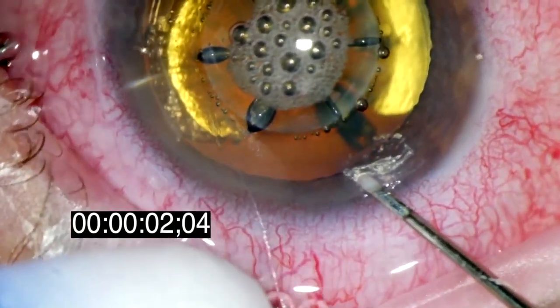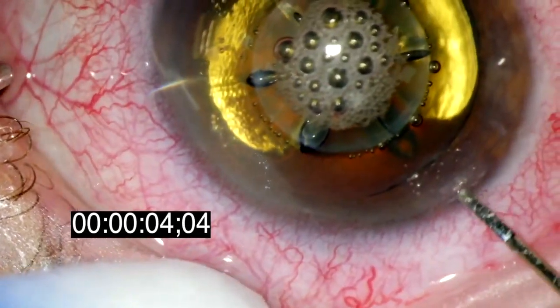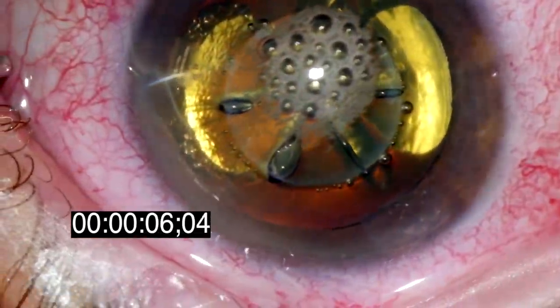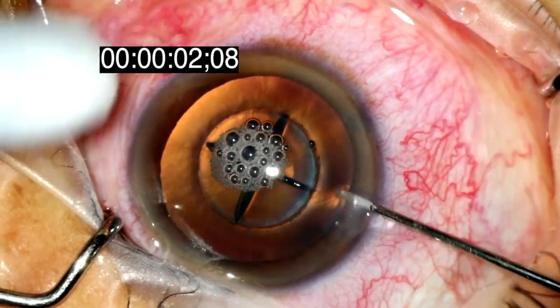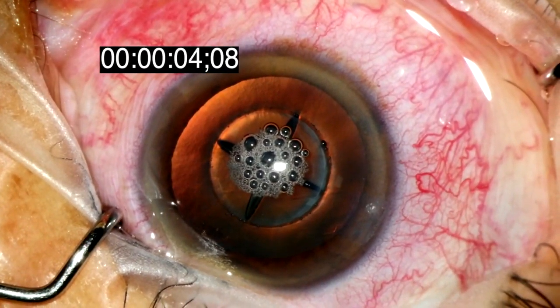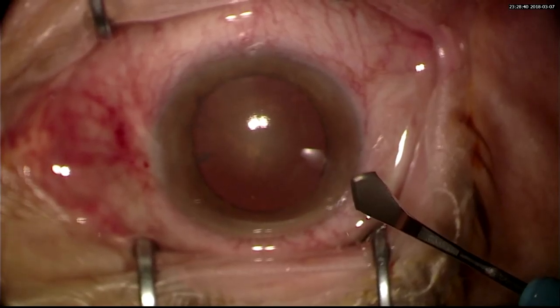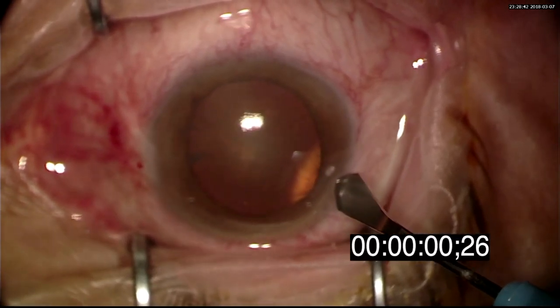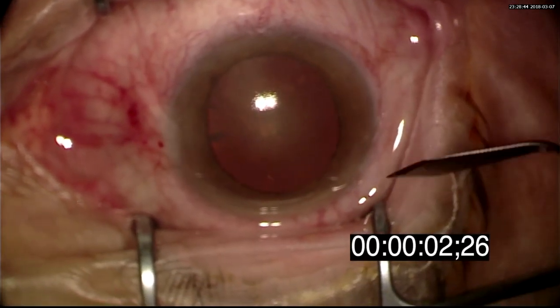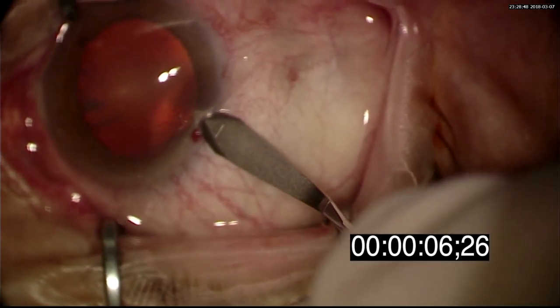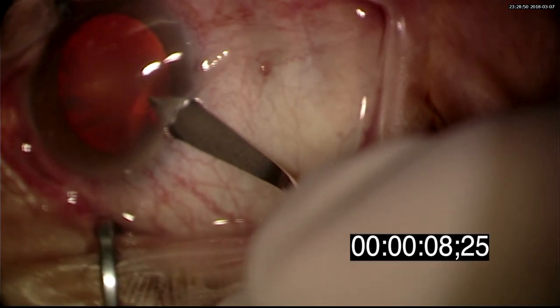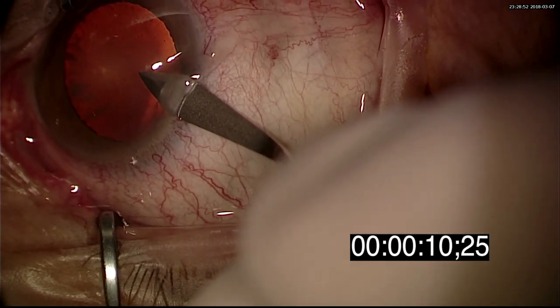Regarding time, opening time presented a mean of 6 seconds. Temporal incisions presented a mean of 5 seconds. To our knowledge, this is the first time that opening time of the incision was used as a surgical indicator. Out of curiosity, we reviewed some opening times of manual incisions. Single-plane stab incisions take approximately 7 seconds to perform.